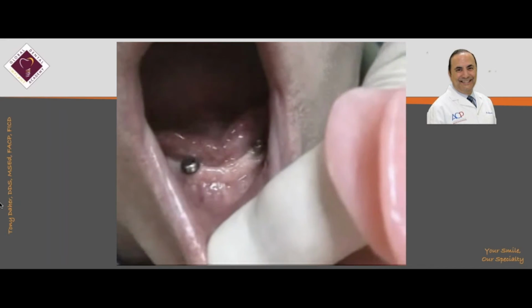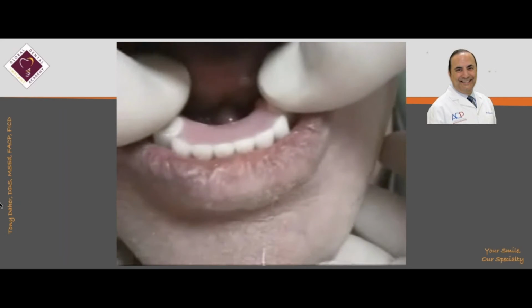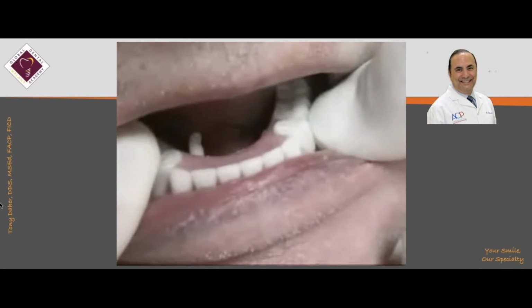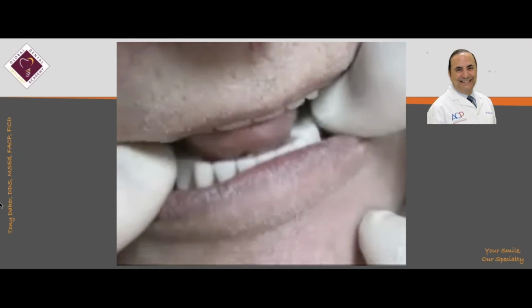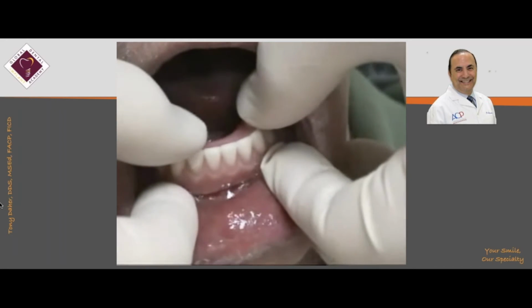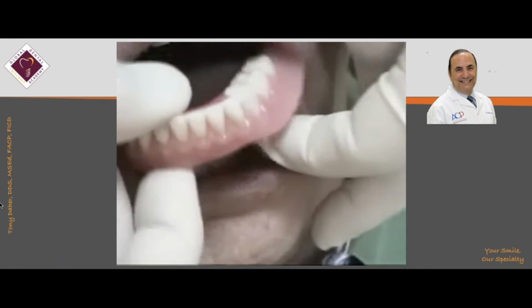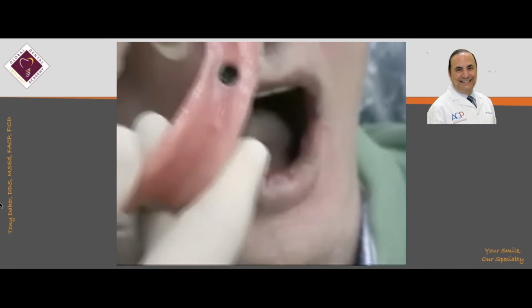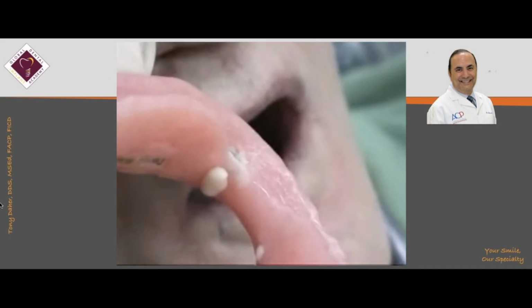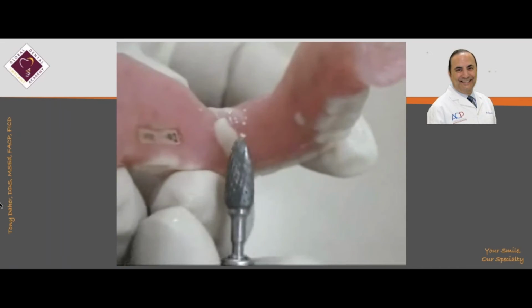And if you notice here, we forgot to put that white nylon ring, but we can catch up the mistake by relieving the gum area around the abutment. And hold it. Okay. So now it's very easy to remove the excess by looking where that tooth-colored acrylic is.